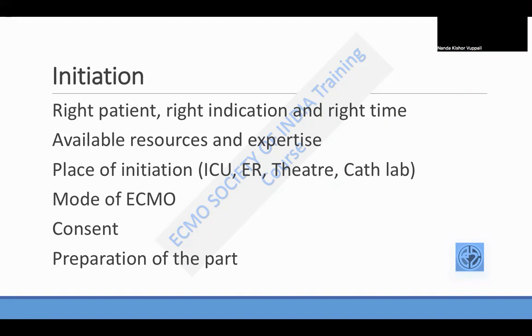And look at what resources and expertise are available. Do you have all the people, or do you need any other help? And where are you going to initiate? Are you going to initiate ECMO in the ICU, emergency room, theater, or cath lab? A lot of it depends on how sick the patient is and what co-interventions the patient would need.